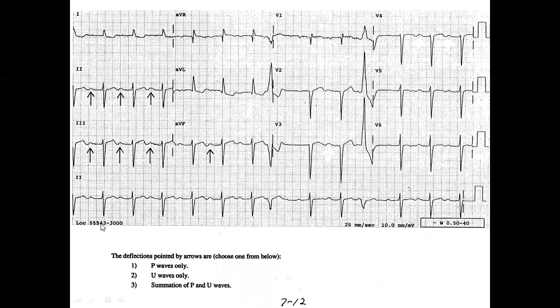Okay, question to you. Is this a P with a first degree AV block? Or is this a U of the preceding cycle? Or is this P and U together? Answer the question. Jeremy, what do you think? P alone or U alone or P and U together?